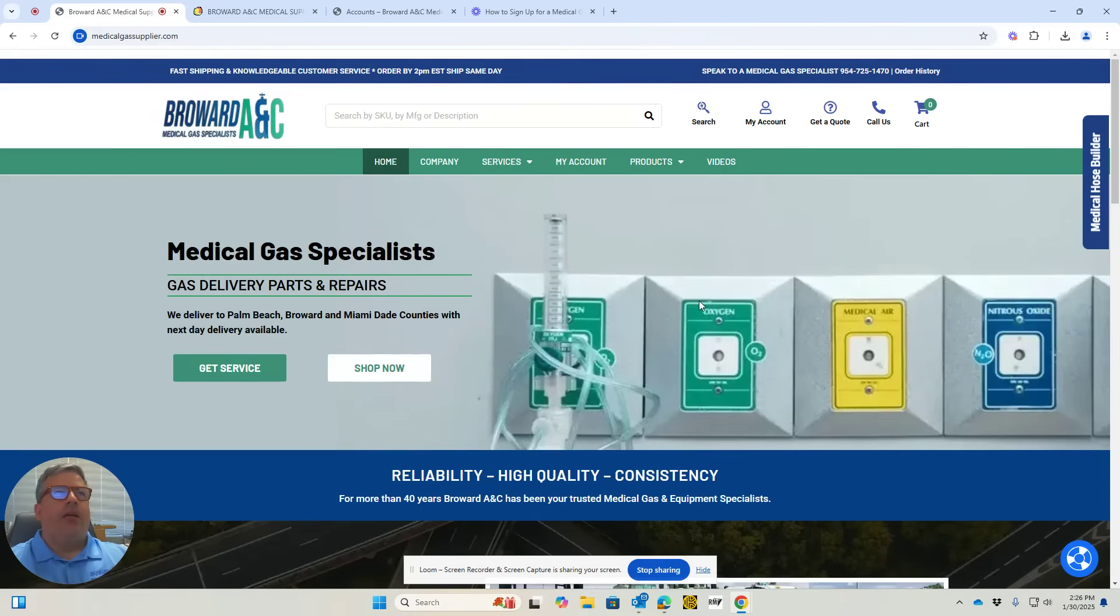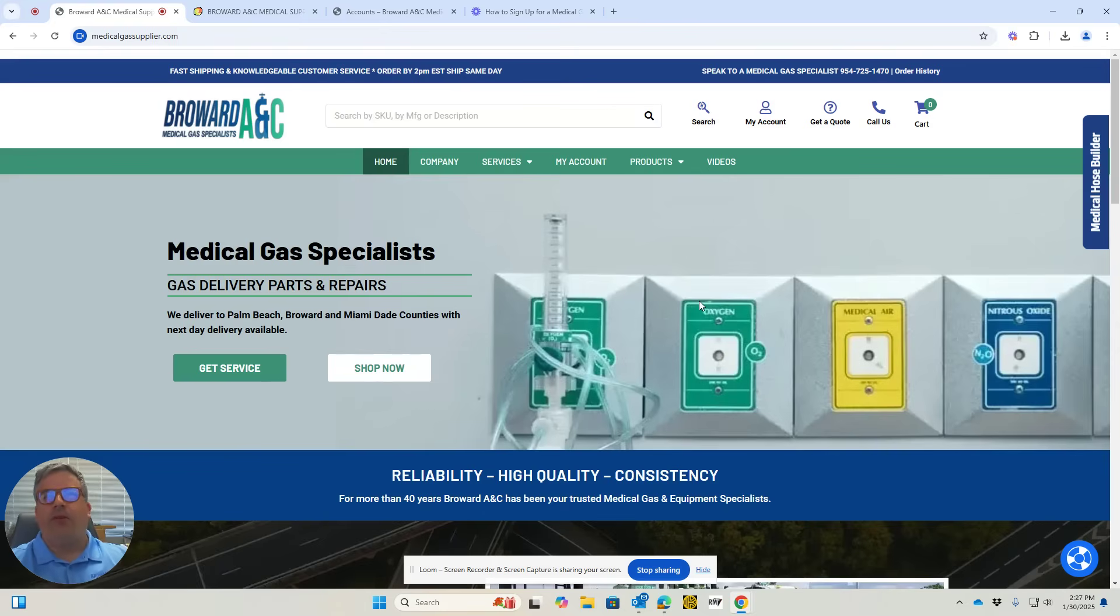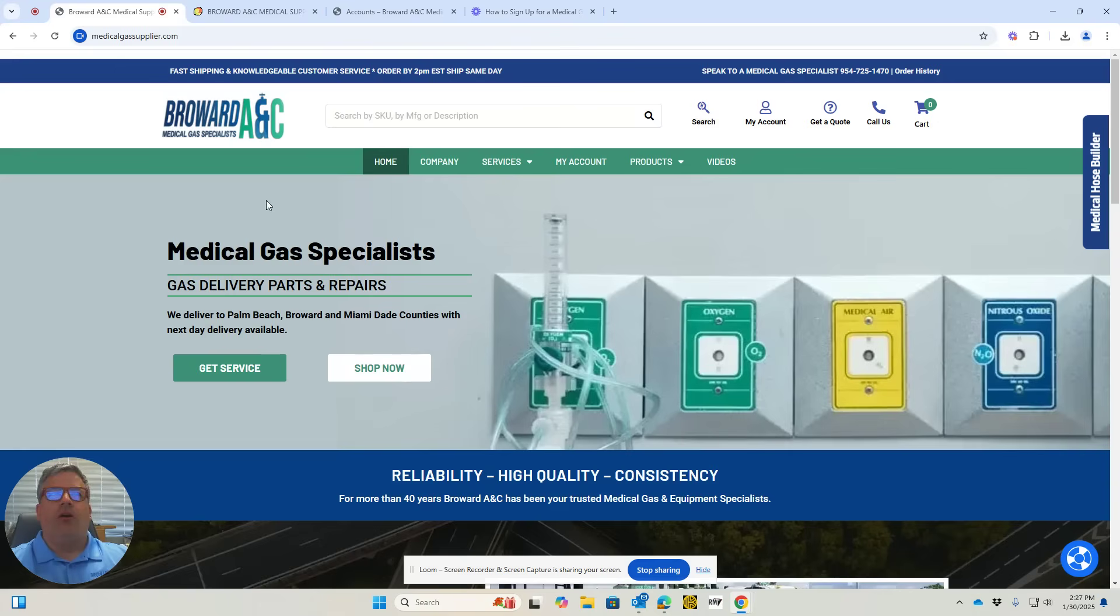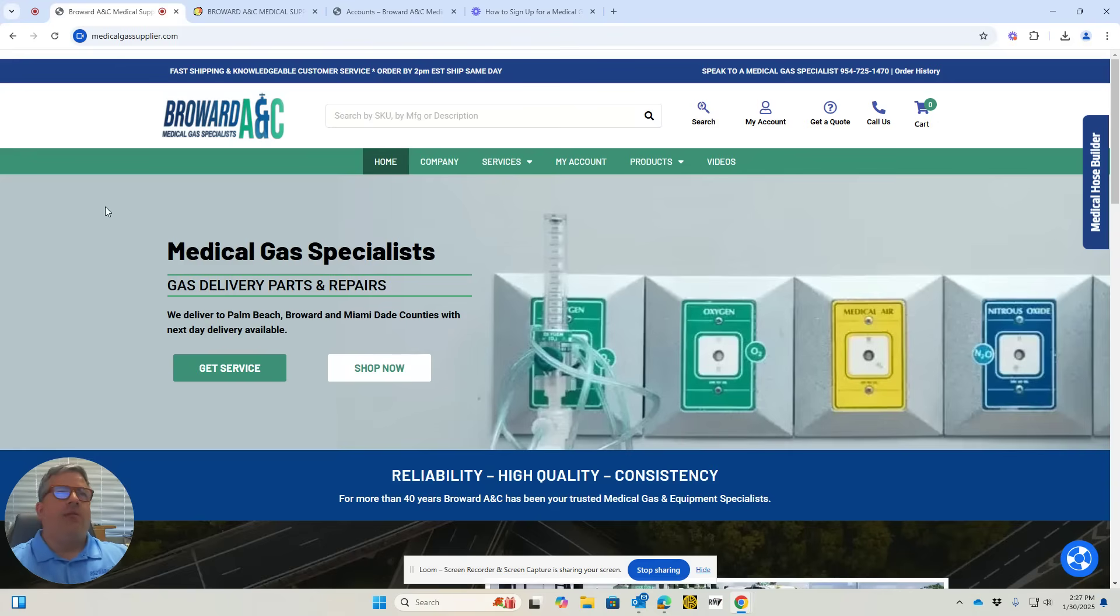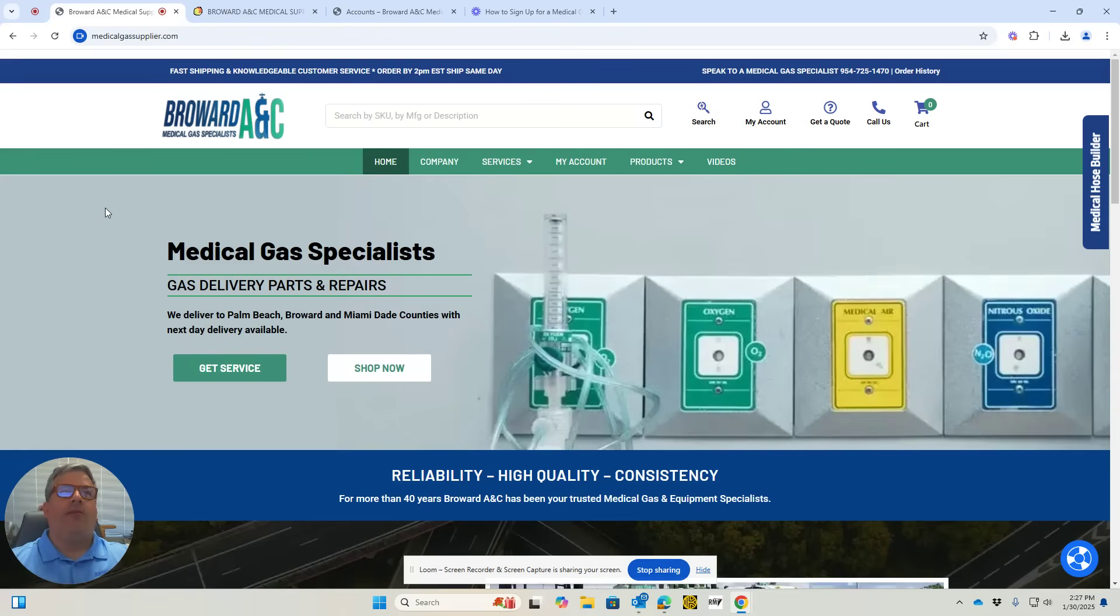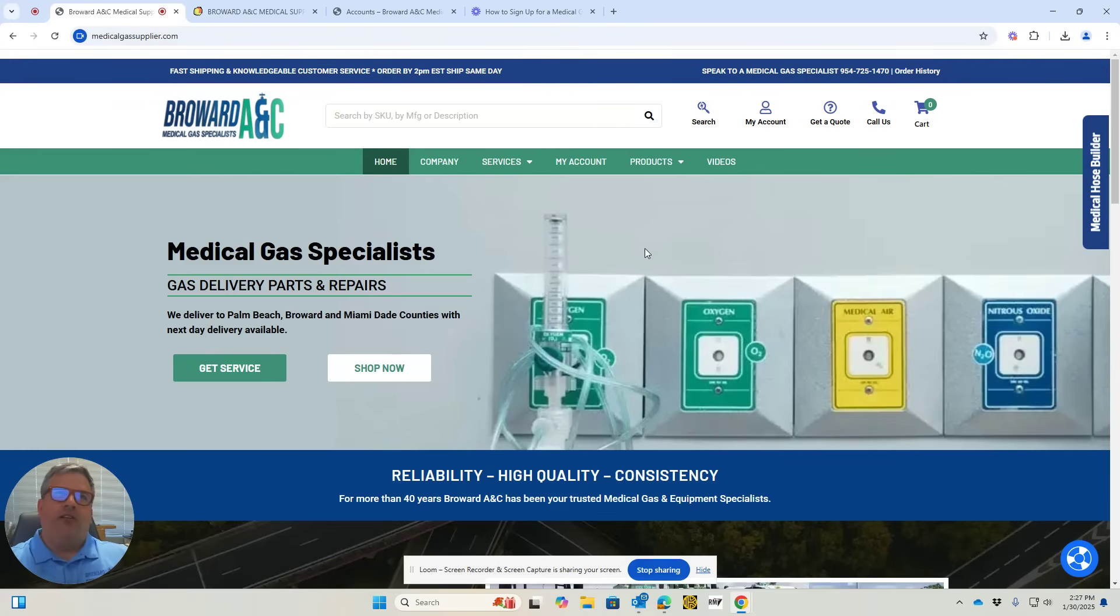I'd like to show you our hose builder. A lot of people need medical gas hoses, especially during the pandemic. We were selling many hoses to hospitals around the country, and we made this hose builder to make it easier for everybody to find what they need. I'd like to show that to you today.